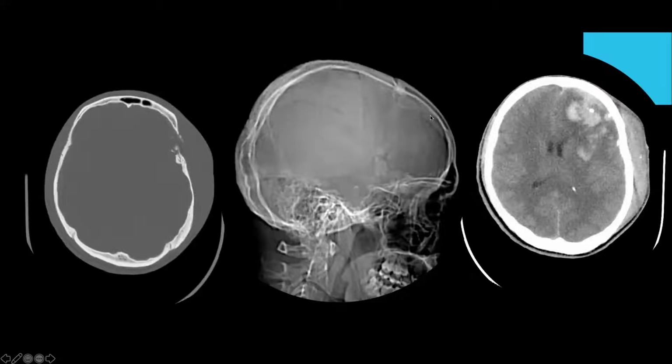So here's a case that I did the CT. So this is the scout film, which doubles as a lateral. So have a look. Yes?